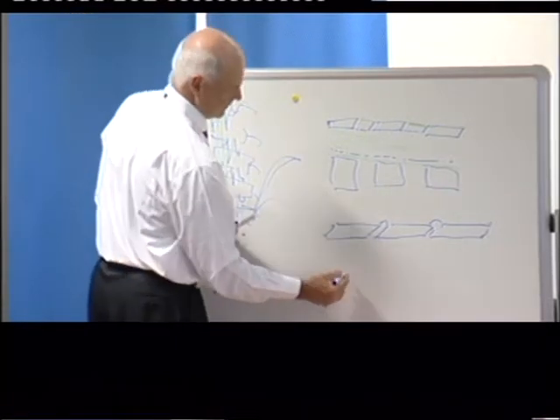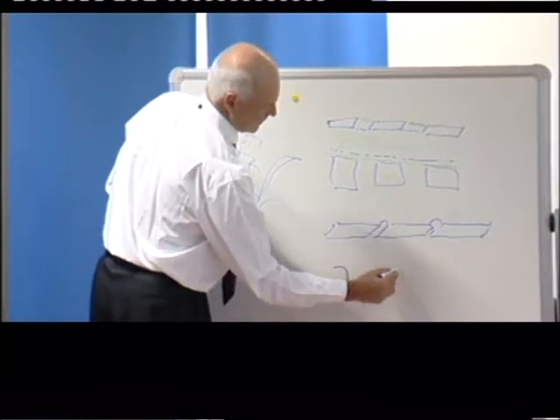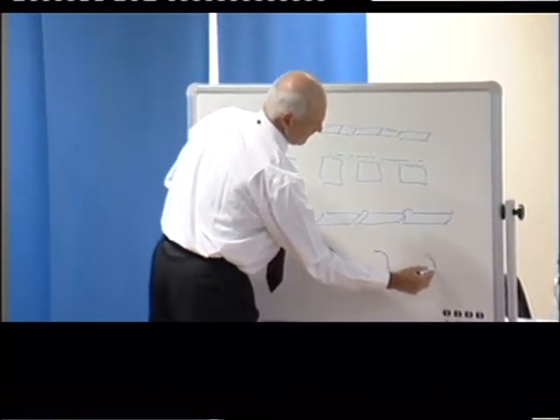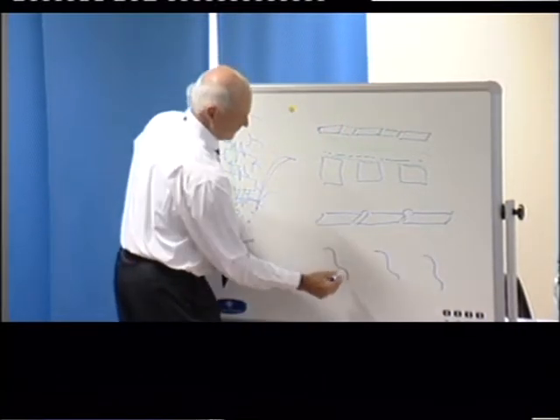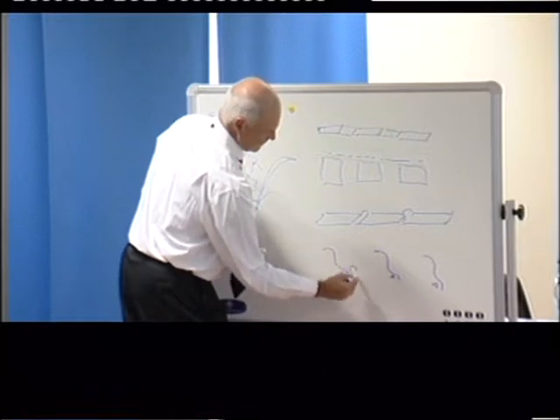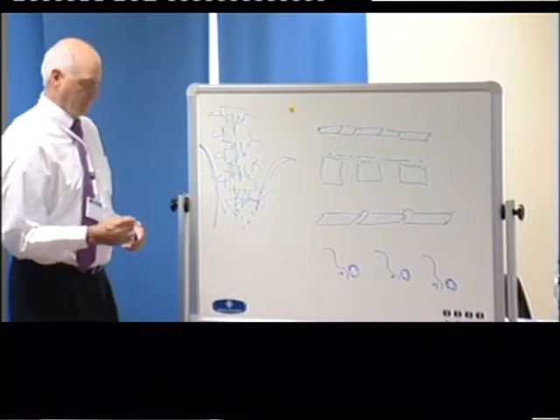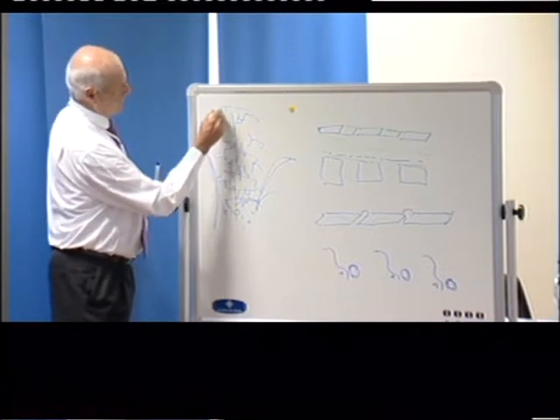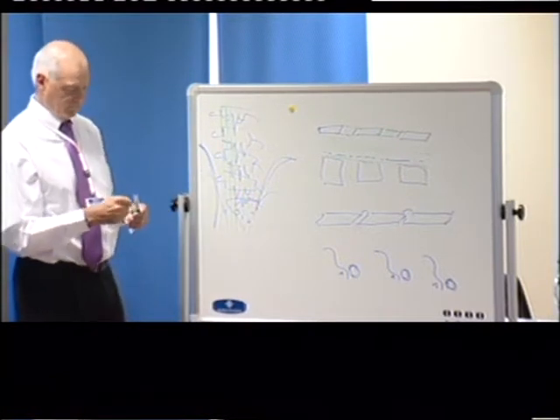The next is going to be, and then this is the pedicle, Pedicolo della... and then this will be the nerve. Qui dovremmo vedere il nervo. So here's the nerve. So we're going to do the next slice. Okay? A quel livello vediamo questo tipo di figura.